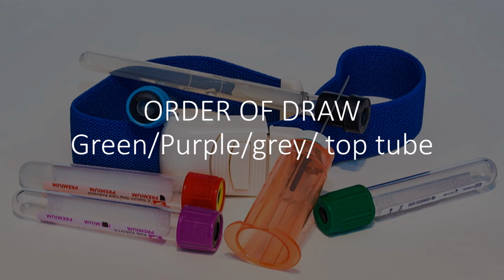But it's also done in that purple top test, but that would be done in chemistry. And then at the very end, we have the gray top tube. Okay, the gray top tube can be used for a couple of other tests like lactate and ethanol testing and things of that nature. But mainly what we see it used for is for glucose testing. When you're doing fasting glucose, or some type of glucose studies, whether it's when women do their gestational, if they're checking for gestational diabetes and they come in to have testing done.